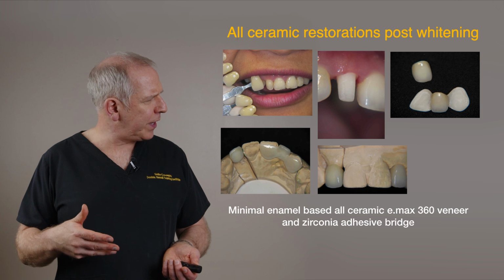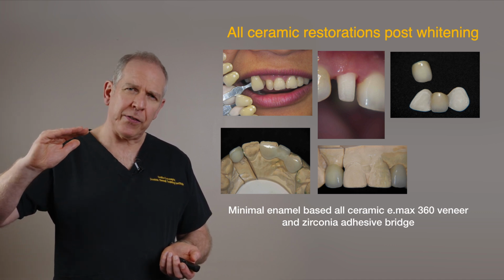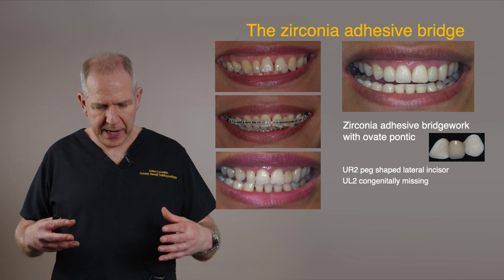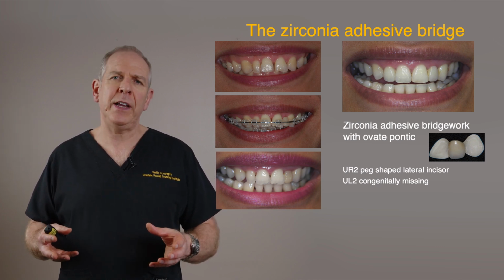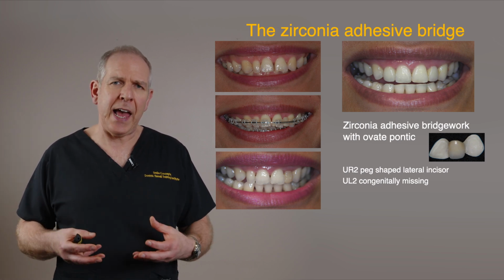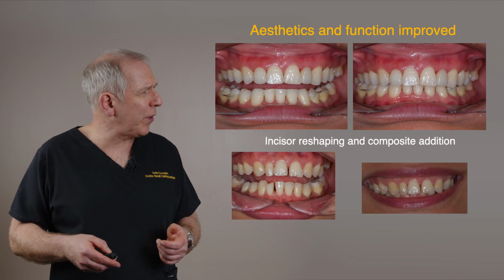But you can see palatally, you can see the beauty of the zirconia adhesive bridge is that essentially we can take it right up to the incisal edge, but you're going to get none of that horrible grey show through. The adhesive bridge is going to have a good longevity because the orthodontist has given us a beautiful protected occlusion. So I think this is a nice case because it shows this synergy between orthodontics, which can help us in terms of aesthetics and occlusion, and then using modern ceramic techniques and implant dentistry to obtain a really lovely cosmetic result at the end of the day. So let's look in some detail at the final result.